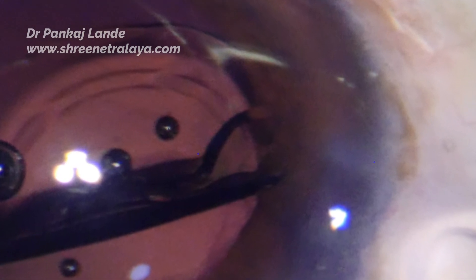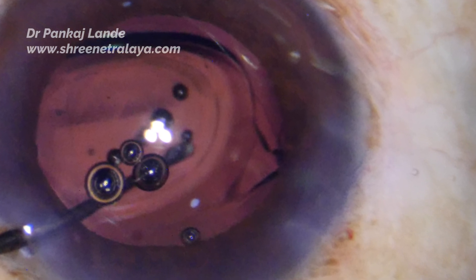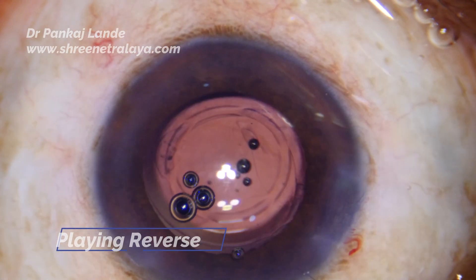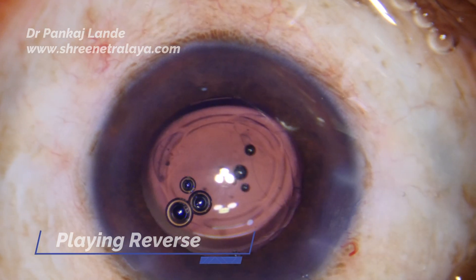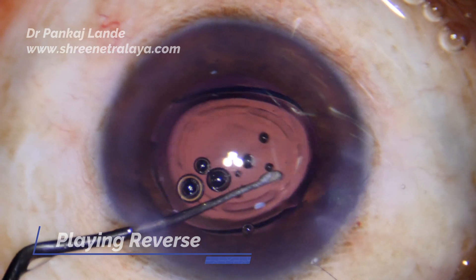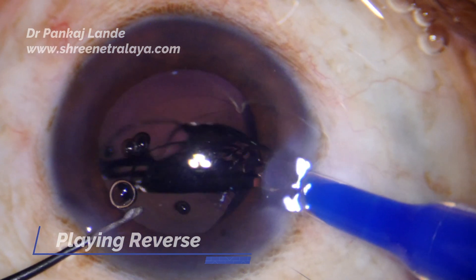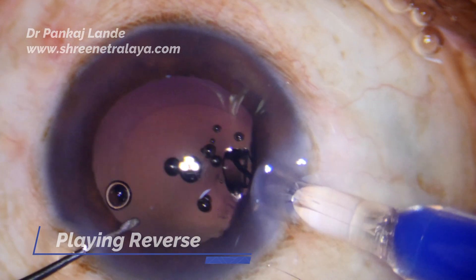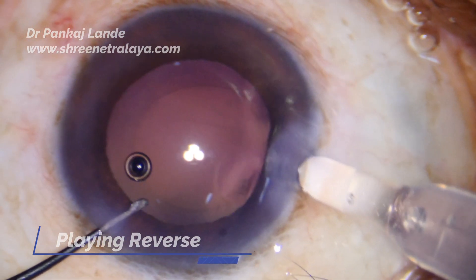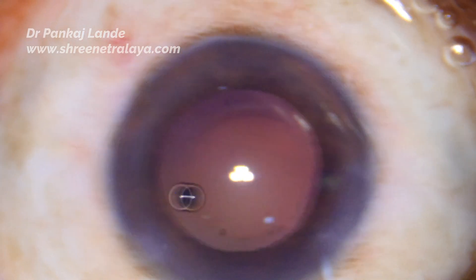To tackle such a situation you always need an instrument which can manage cutting the IOL into multiple pieces and then removing it with ease. There are many mechanical instruments and IOL cutting scissors available in the industry. Playing back the video in reverse, we can note the silicone tip has stuck the IOL trailing haptic and it is broken. IOL exchange is the only option. This is the IOL cutting device.